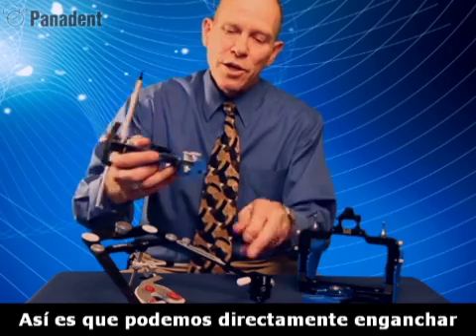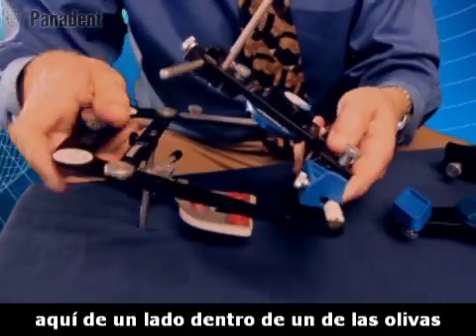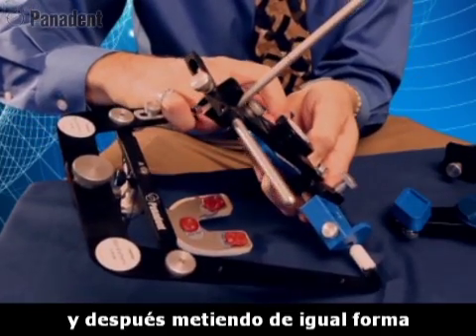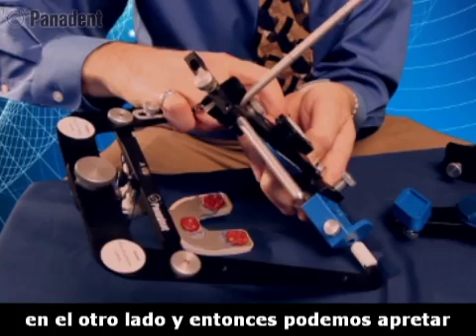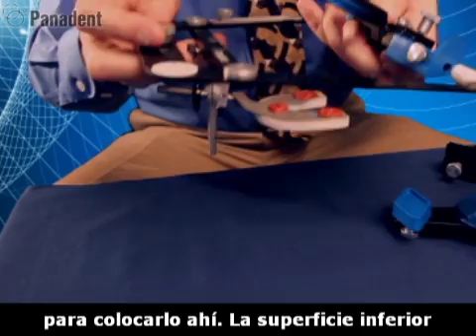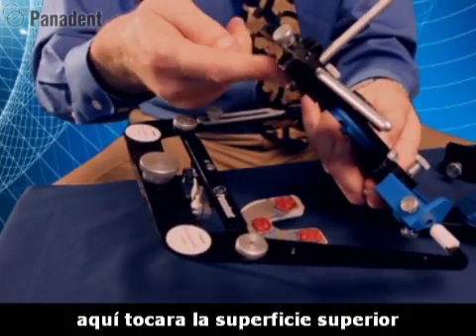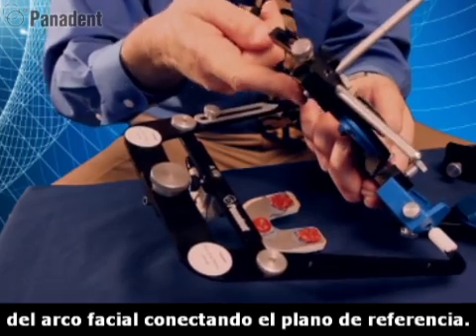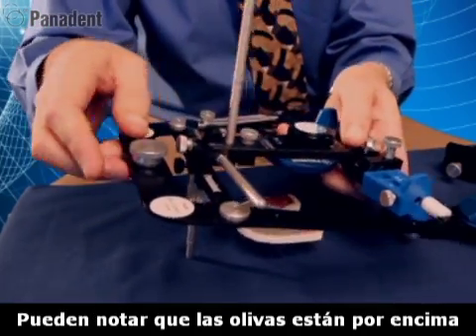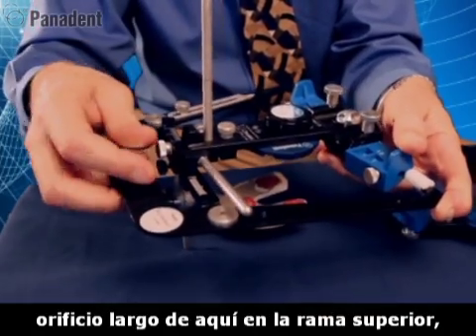We can hook this directly to the face bow by clipping one of the pins on the side into the earplug, and then clipping in the other side, and tighten that into place. The bottom surface here will touch the top surface of the face bow, connecting our plane of reference. You can also notice that the earplugs are behind and above the axis, which is represented by the large hole here of the upper frame.